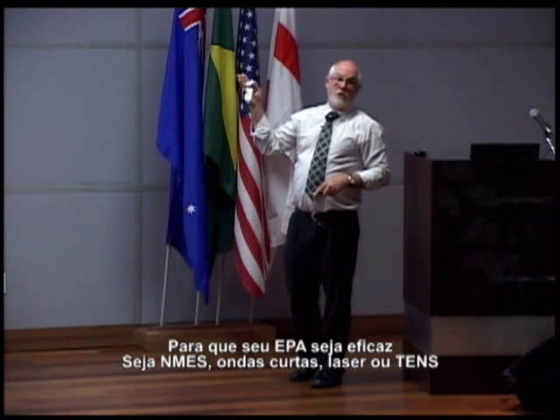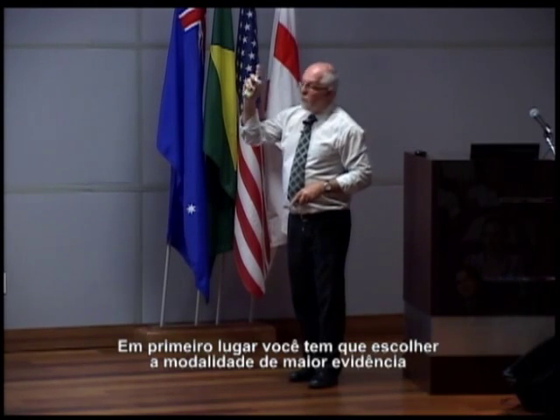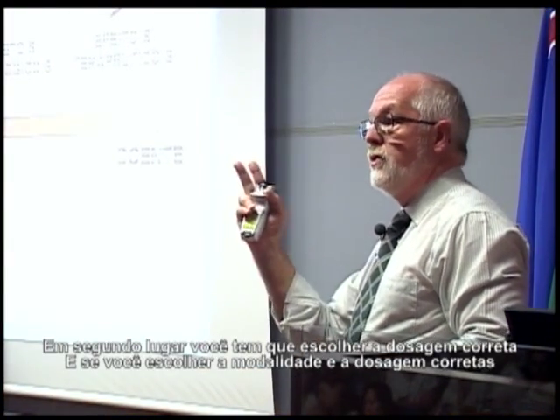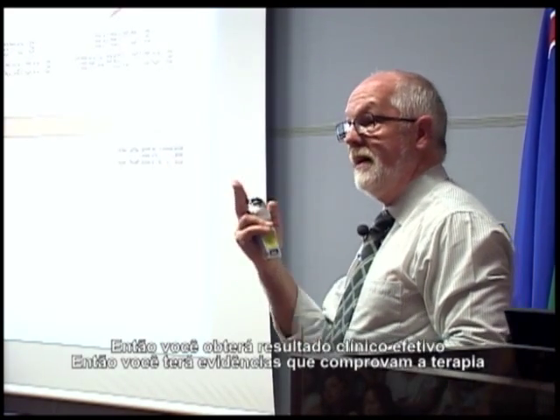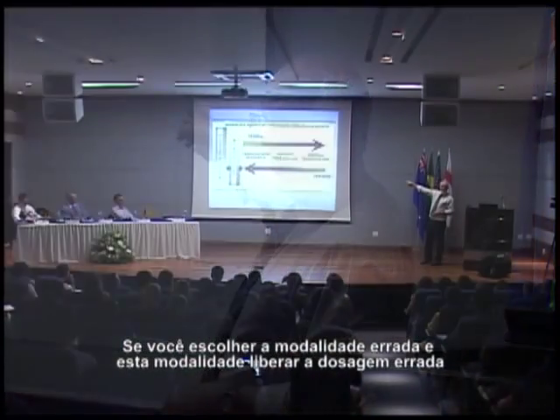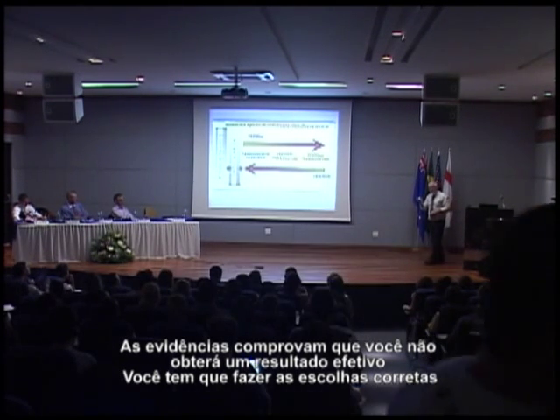So in order for your EPA to be effective, whether it's NMES or shortwave or laser or TENS, number one, you must choose the most evidenced modality. Number two, you must get the dose correct. And if you get the modality correct and the dose correct, then it's clinically effective. There is evidence to support therapy. If you choose the wrong modality, or you choose the modality and deliver at the wrong dose, the evidence says you will not be effective. So you must get the choices correct.